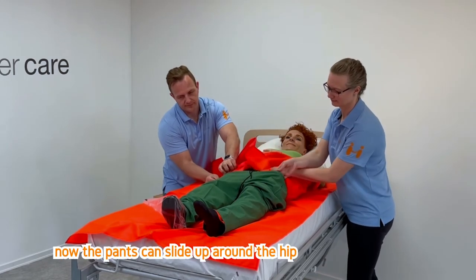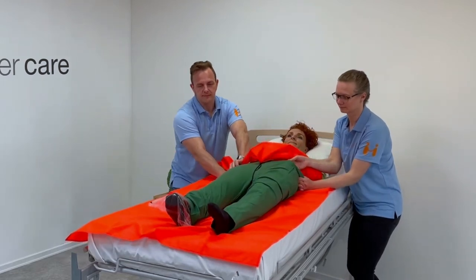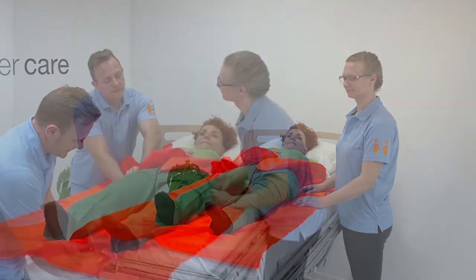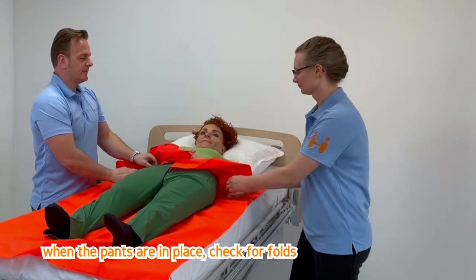Now the pants can slide up around the hip. Remove the second plastic bag. When the pants are in place, check for folds.